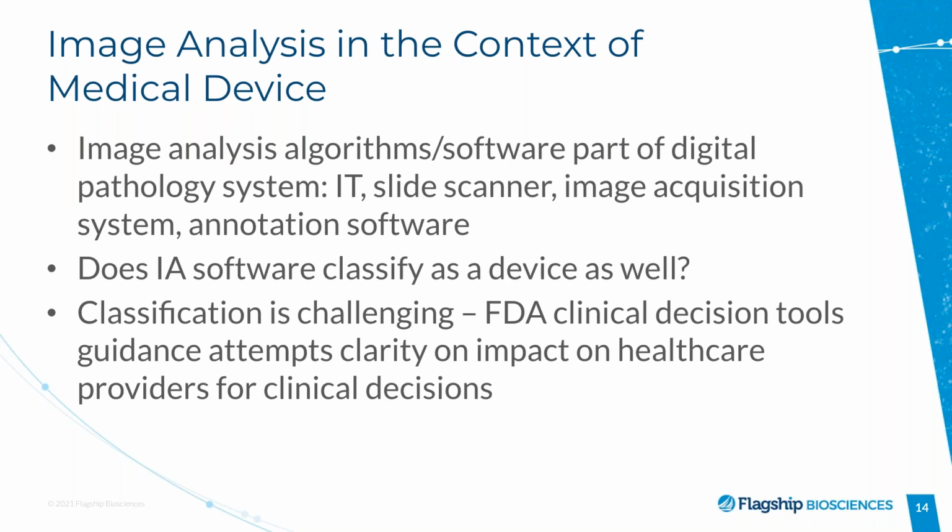And this is even more true when you try to make this assay a device. So you're trying to go from an LDT to a device, because the degree of work that has to be done to validate the assay and to keep doing the QC of the assay while it is working is very, very high. The classification of the assay and the type of risk associated with each of these devices is also complicated because we are in new territory here. There is no well established precedent to classify things one way versus the other in terms of the risk.